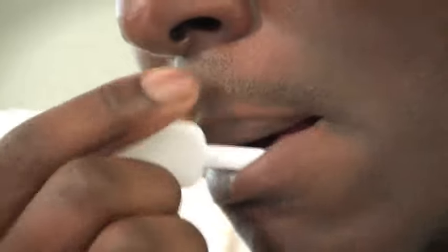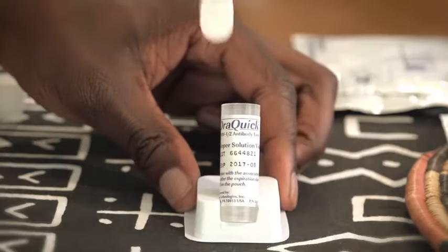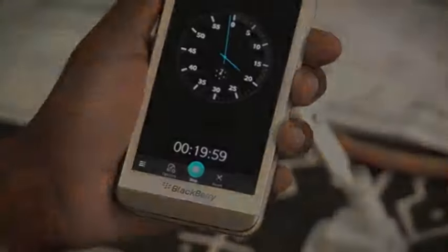Press the flat pad firmly against your gum and wipe it once along the upper gum and once along the lower one. Put the flat pad all the way into the tube until it touches the bottom. Leave it there for 20 minutes before reading the results.